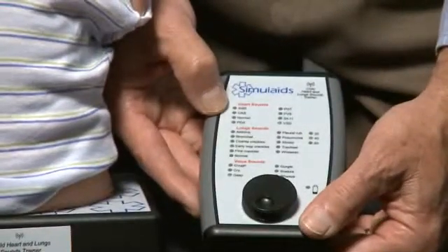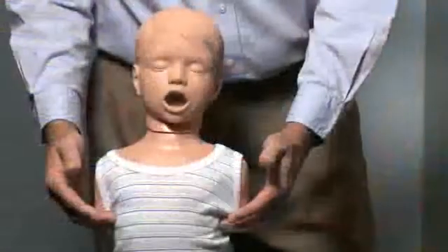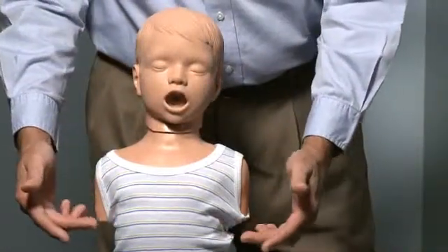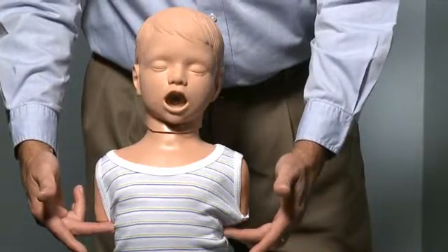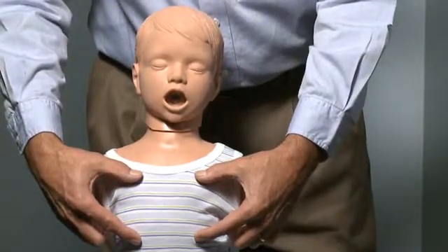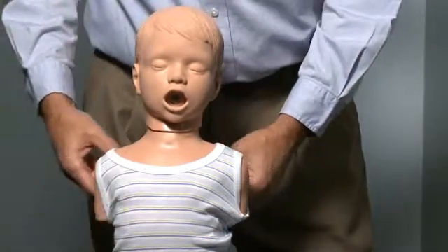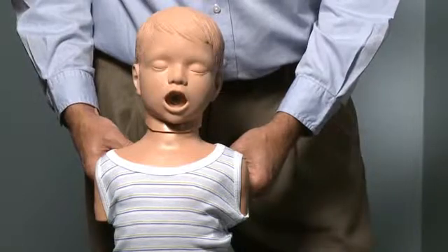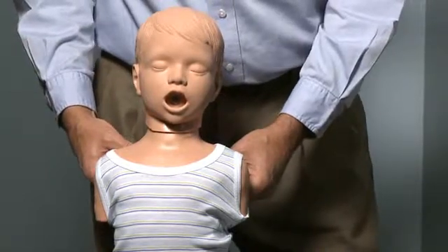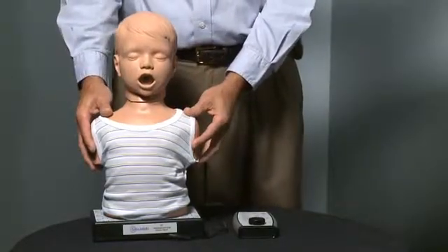All three of those sounds are active on the mannequin. There are ten speaker locations: two under the armpits, four for lung sounds on the front, one heart sound location, and four lung sound locations on the back. Each of these sounds can be heard in each of the areas, and you can complicate listening to the heart and lung sounds by adding voice sounds to it.